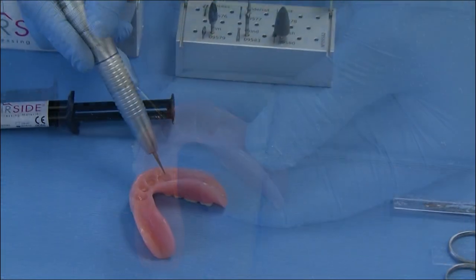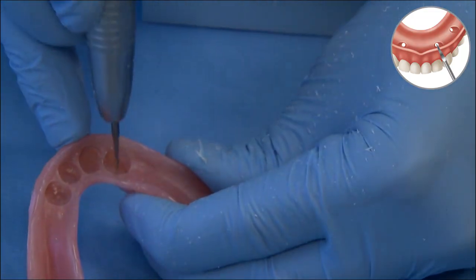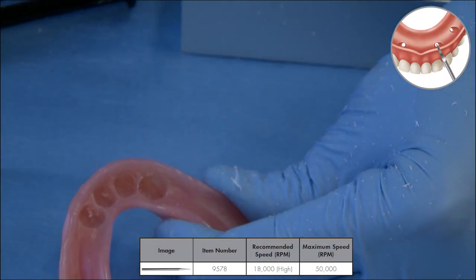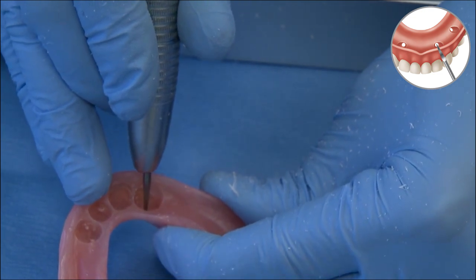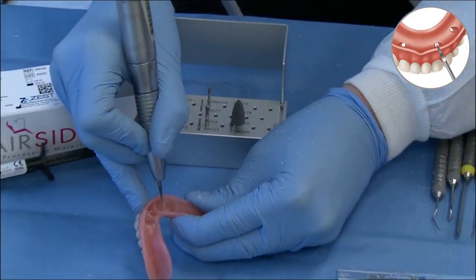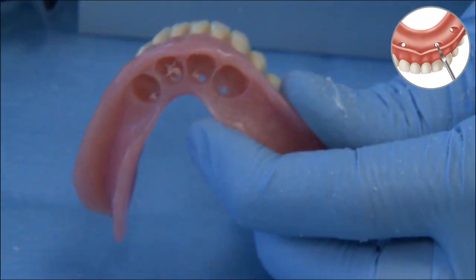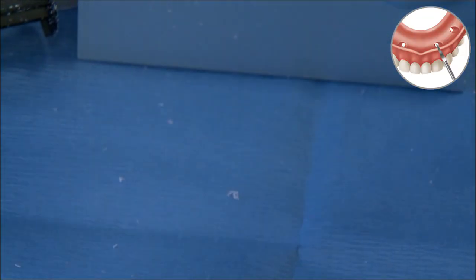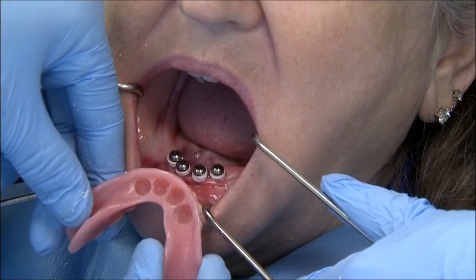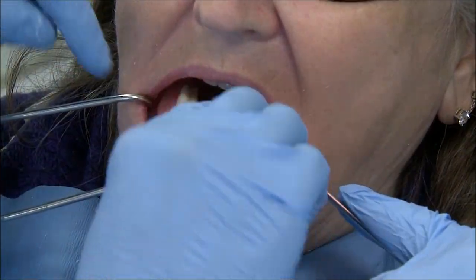Now that we're done using the undercut burr, we switch to the third burr — the vent hole burr. The vent hole burr is essentially a four-sided triangular-shaped instrument that very precisely and easily allows you to prepare a lingual or palatal vent hole. It's used at the junction of the superior surface of the recess hole and the palatal or lingual slope of the complete denture, inserting in and out, and sometimes you also run the burr from the intaglio surface direction. A lingual or palatal vent hole aids in chairside material coming out through that vent hole to minimize the amount of resin flash on the edentulous ridge.